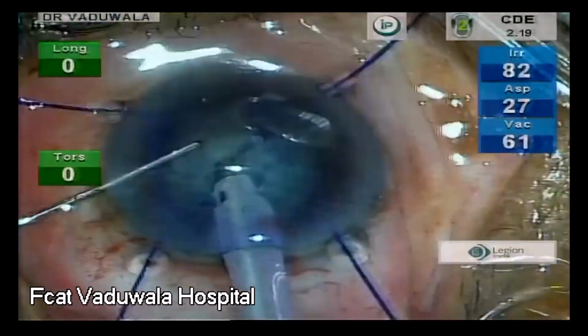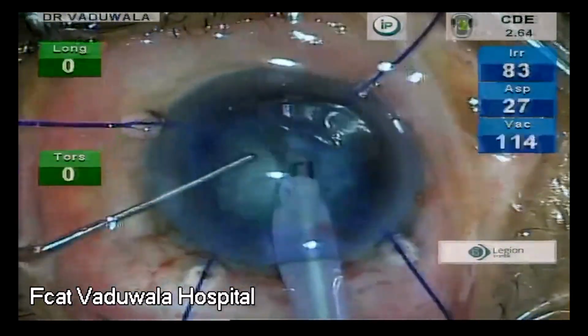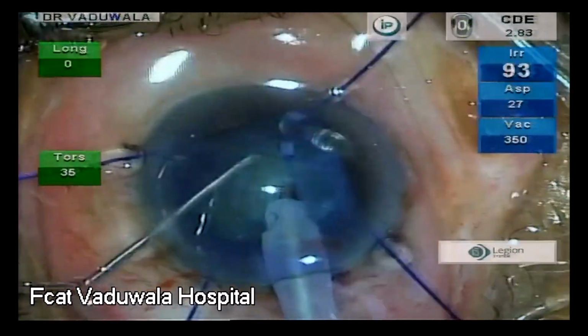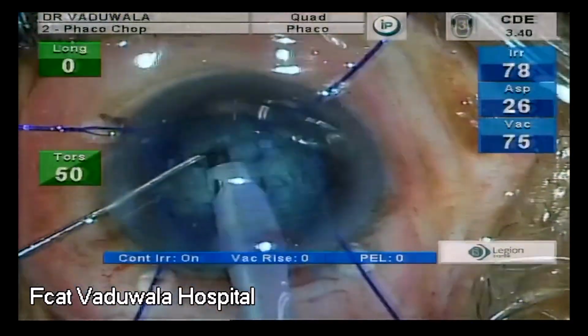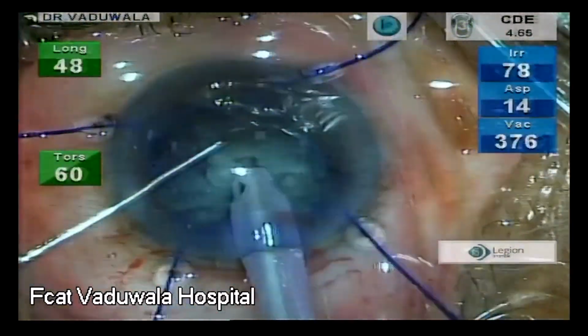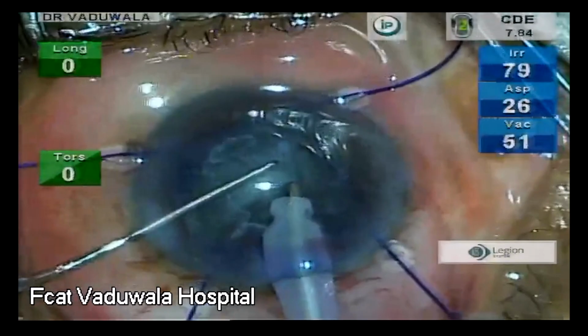We are demonstrating this technique in grade 2+ cataracts and moving on to higher grades of nuclear sclerosis. Staining the anterior capsule helps in deciding the width of the central well and also helps in demarcating our Lakshman Rekha of safety, beyond which both the instruments are prohibited to pass through.